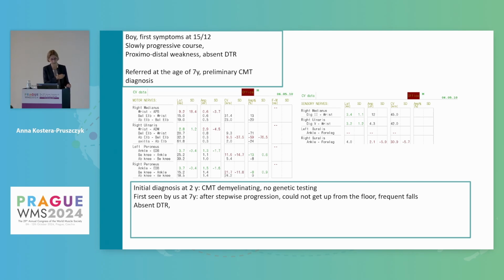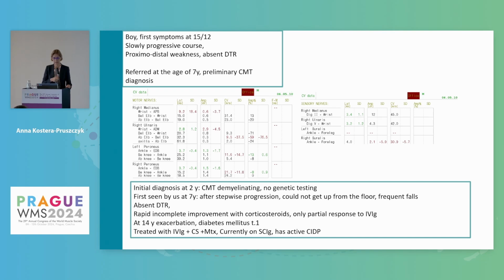And if we compare it with the pattern seen in CMT1 family, this is really heterogeneous with different degree of nerve conduction slowing in different motor nerves of his upper extremity, 23-30 in median and less than 10 meters per second in ulnar, and also quite a variety in terms of amplitude of his CMAP, and definitely neuropathy is sensory motor. He was diagnosed with CIDP.